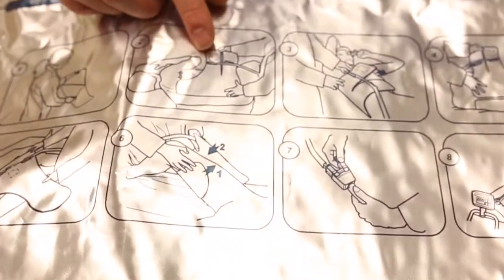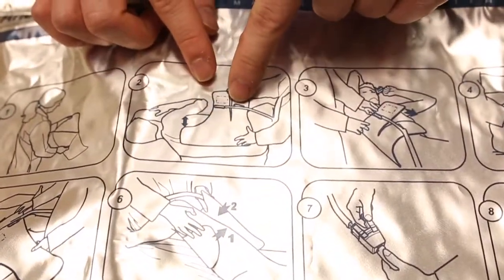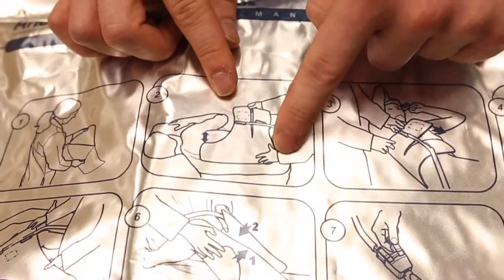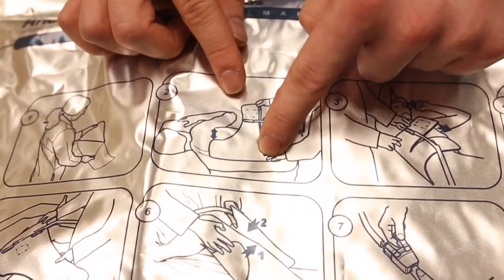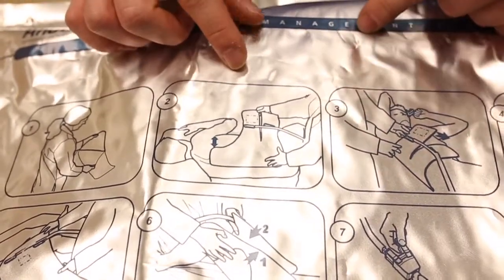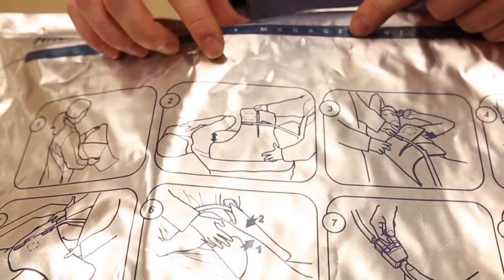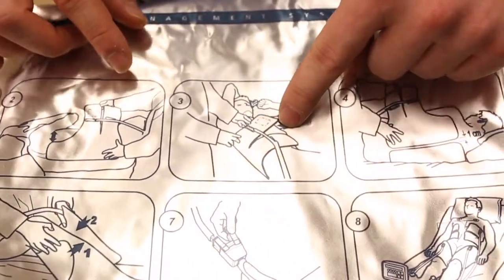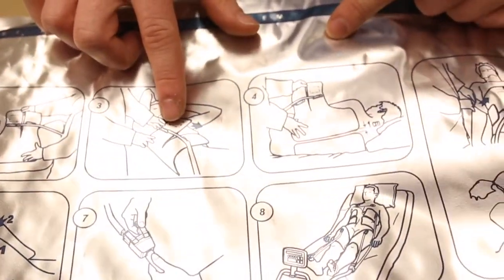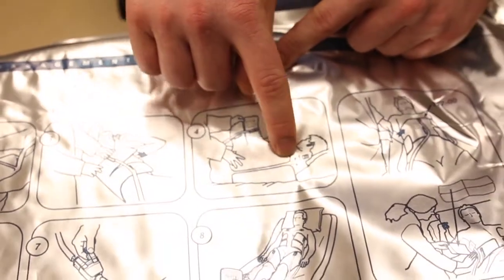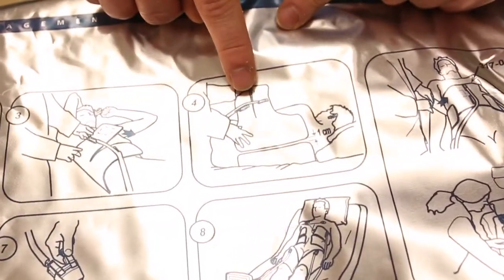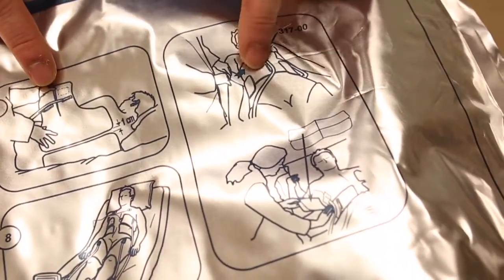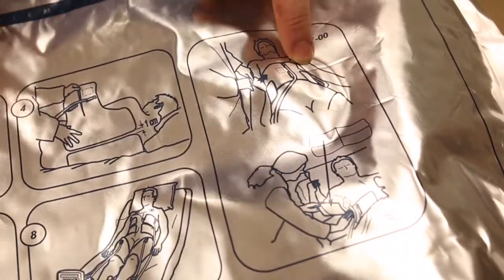The back and chest pads go on first. Roll your patient, put the larger side there - there will be instructions directly on each pad showing which side and where they go. Then roll them back over and put the pads on here. You want one centimeter between the pads on the back as indicated, and this is what it'll look like on the front.